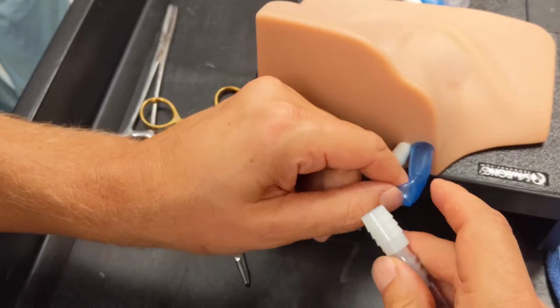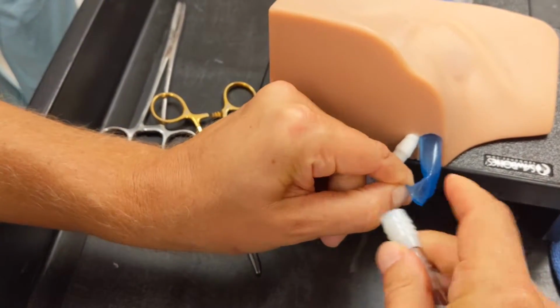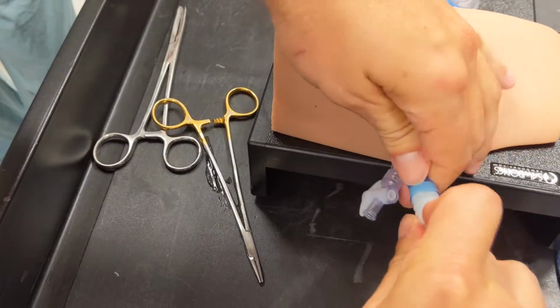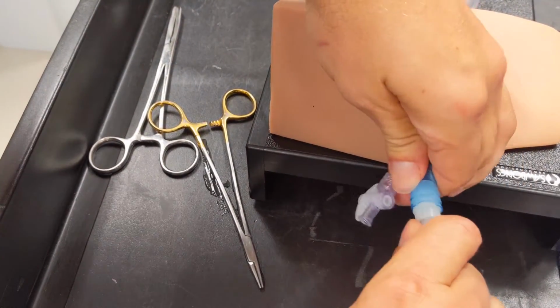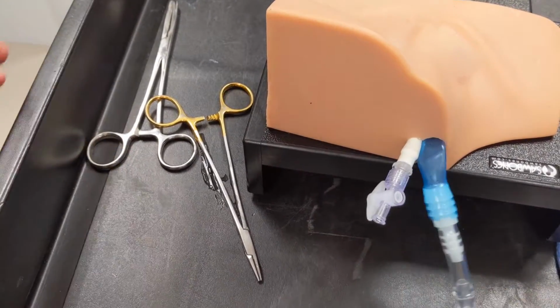For the IJ, it's a little harder to get this on. I kind of just fold it like that. Make sure all the lube is off, and then you just work it on. Make sure it goes up really high, and that's good.